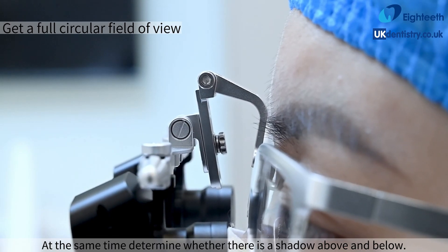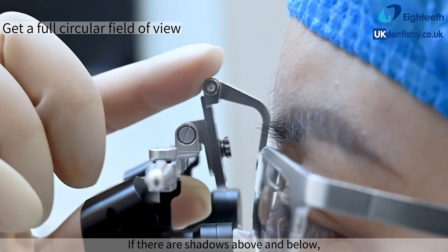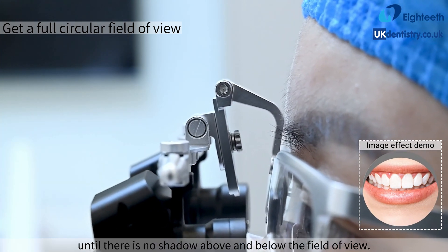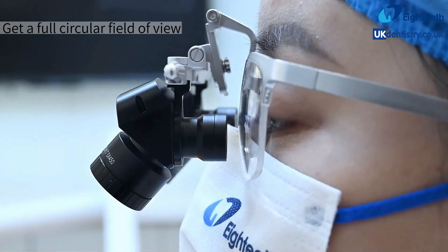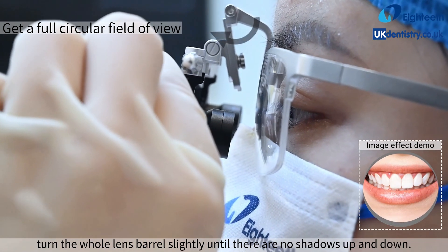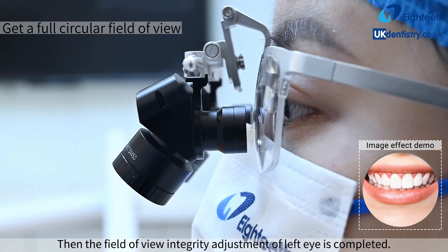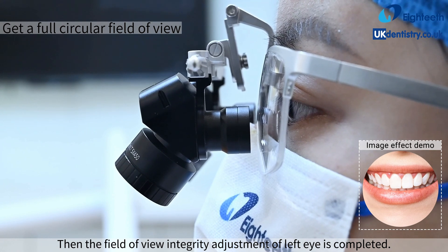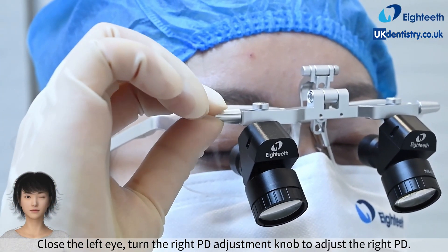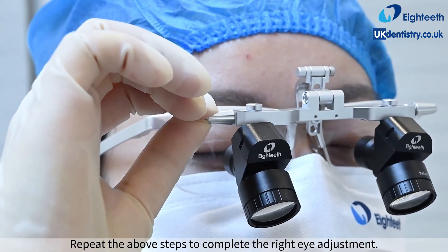At the same time, determine whether there is a shadow above and below. If there are shadows above and below, push the pupil height adjustment slider to adjust the pupil height until there is no shadow above or below the field of view. If shadows persist after adjusting the pupil height, turn the whole lens barrel slightly until there are no shadows up and down. Then the field of view integrity adjustment of the left eye is completed. Close the left eye, turn the right PD adjustment knob to adjust the right PD, and repeat the above steps to complete the right eye adjustment.